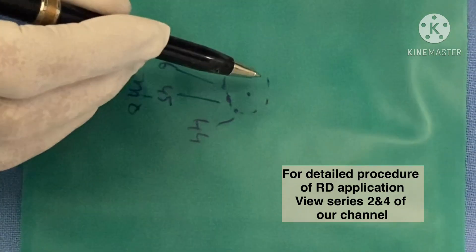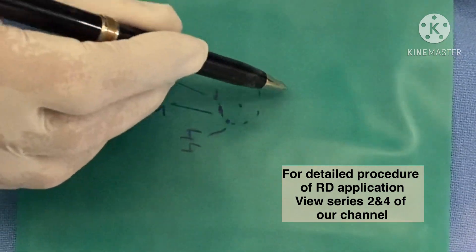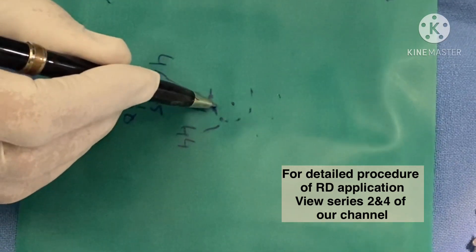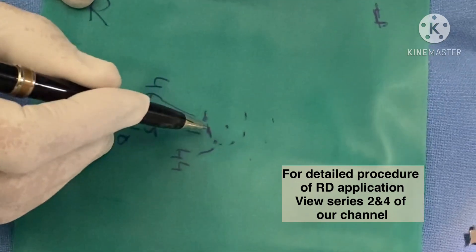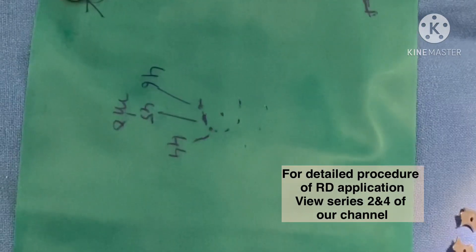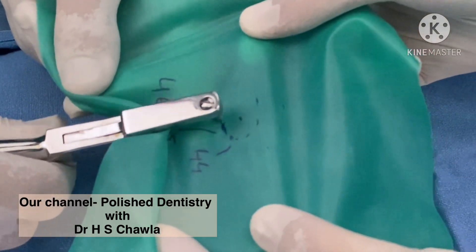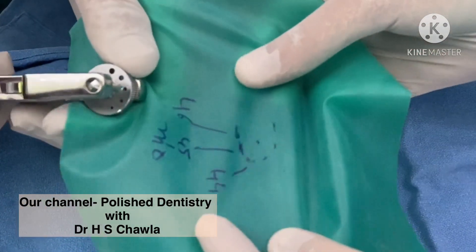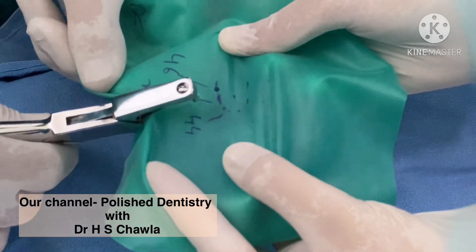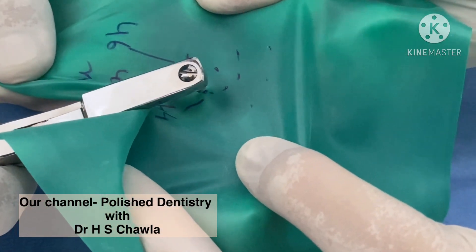What we have done is drawn the line for the lower jaw. It is a small circle, not a big one as I told you before, and we mask for 4-6, 4-5 with a little extension for the MO cavity, and 4-4. Now I will do the punching. We first punch 4-6, then move it to 4-5, which is the premolar, and then do it for 4-4.